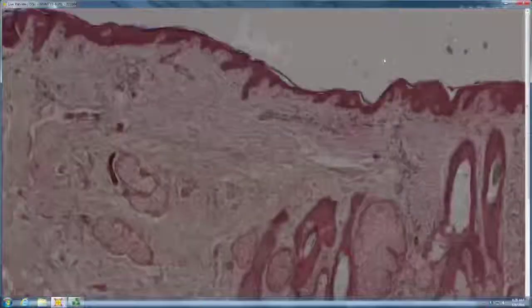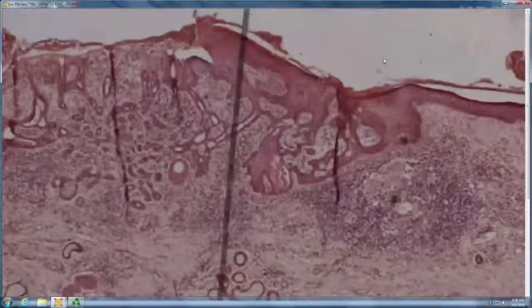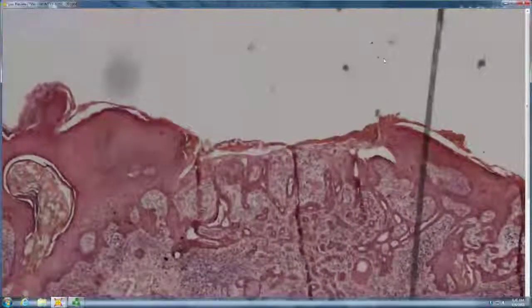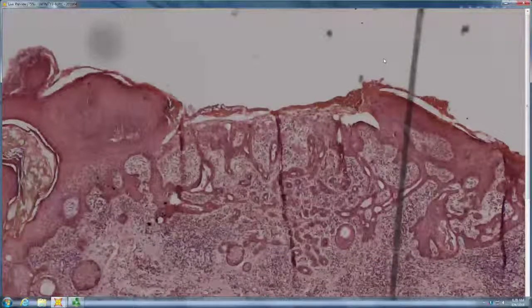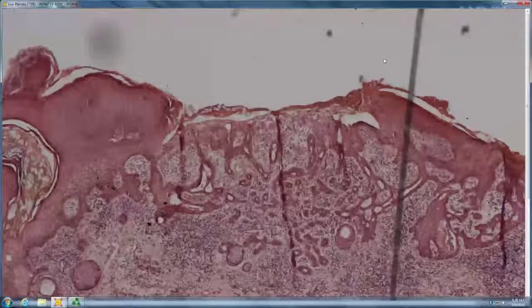Okay, what's this? This is a nevus sebaceus. What's all of this kind of weird sweat gland tumor in it? The answer is it's a weird little sweat gland tumor, right? So can you get little secondary tumors of all sorts in nevus sebaceus? Sure you can. Are they ever malignant? Rarely. Even if they're funny looking, they're usually benign.